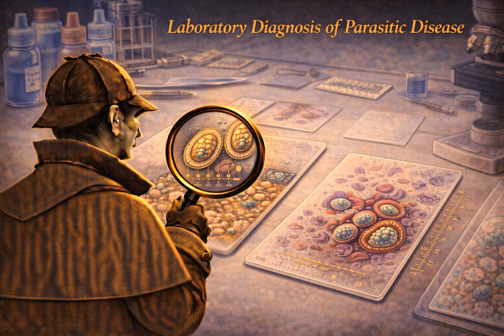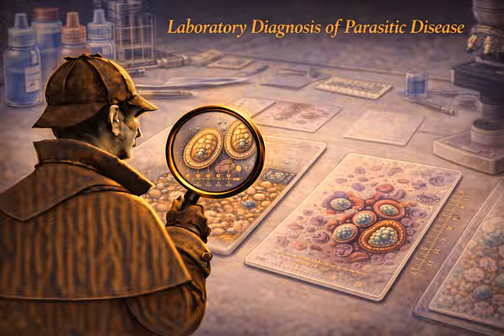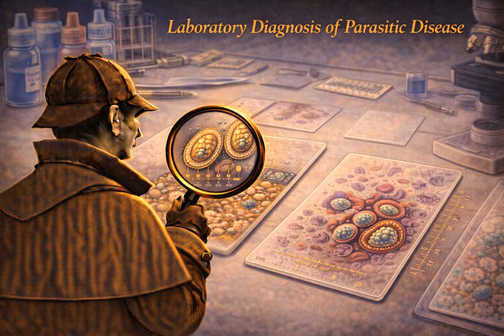You literally go fishing. The patient swallows a specialized gelatin capsule. Tightly coiled inside that capsule is a very long, highly absorbent nylon string. The bitter end of the string is left hanging out of the patient's mouth and gets securely taped to their cheek. The capsule goes down, dissolves in the stomach acids, and the string unwinds. Normal gastric peristalsis carries the weighted end of that string all the way down into the duodenum. And how long do they just sit there with a string down their throat? Usually about 4 hours, sometimes overnight, depending on the protocol.